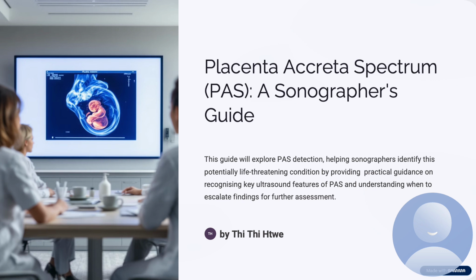So in this section, I'm planning to explore a condition that has become increasingly relevant in our obstetric practice called placenta accreta spectrum, or PAS. This spectrum ranges from accreta to increta to percreta, posing significant challenges in our diagnostic and management plans. As sonographers, you play a pivotal role in early identification, often making the huge difference between a planned controlled delivery and, if we don't recognize it, a life-threatening obstetric emergency.